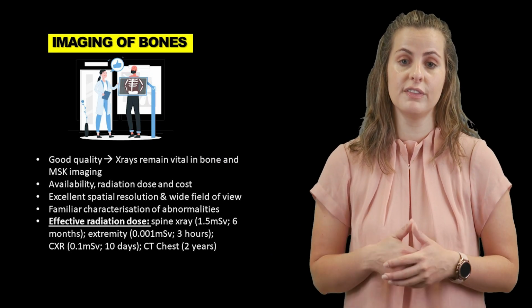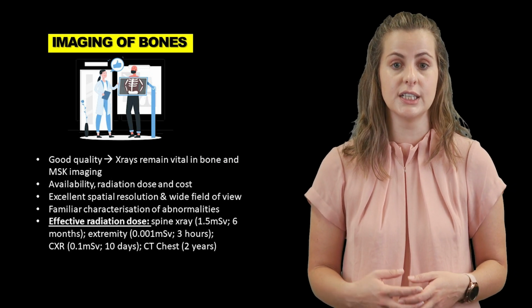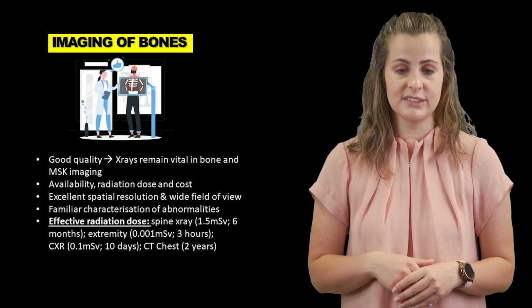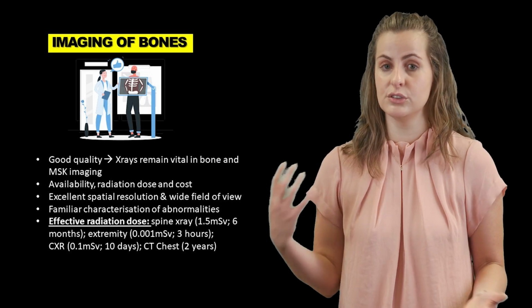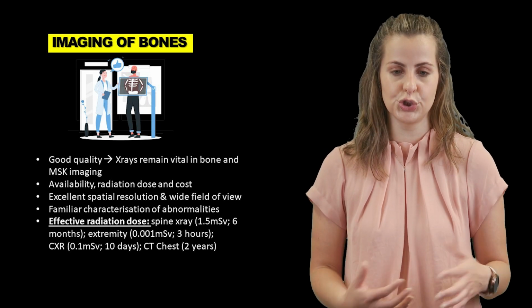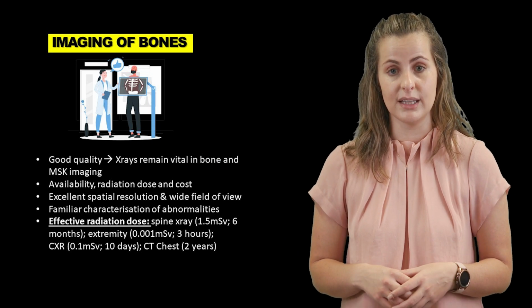X-rays are readily available, they're relatively cost efficient and cheap, and when we're looking at the radiation dosage, there are a variety of things that we can do to actually limit or reduce the radiation exposure to the patient. It has excellent spatial resolution, and the field of view typically will capture what we're looking for in the case of fractures or dislocations or obvious pathologies or cysts or tumours. And then also there's familiar characterization of abnormalities.